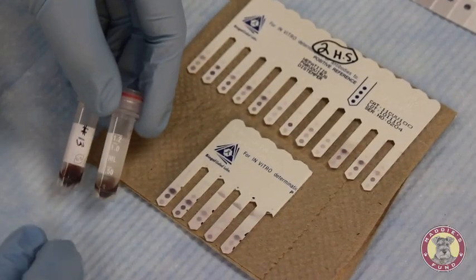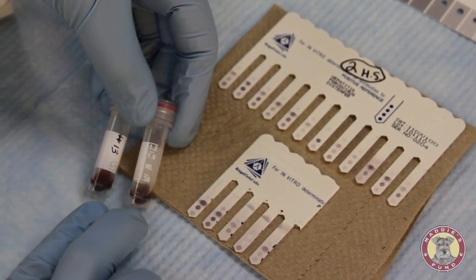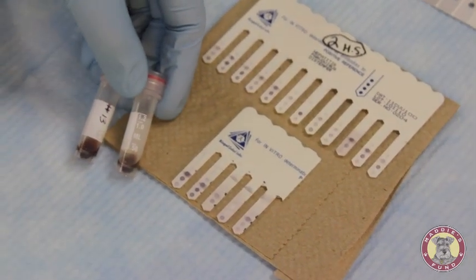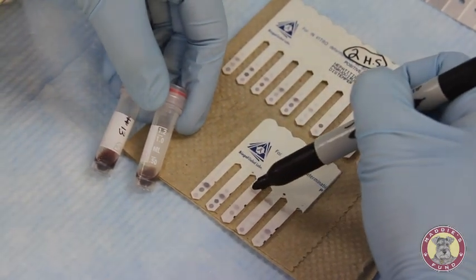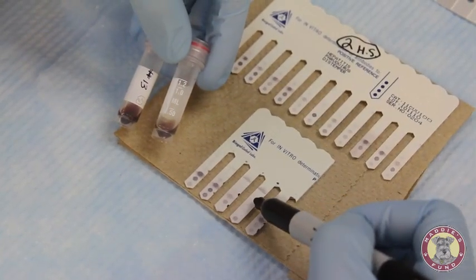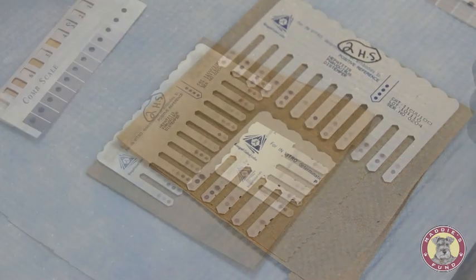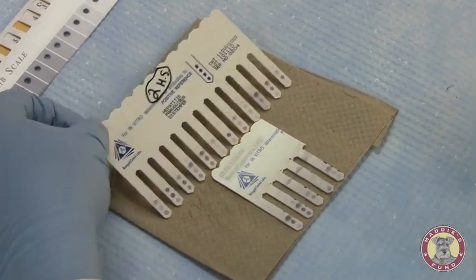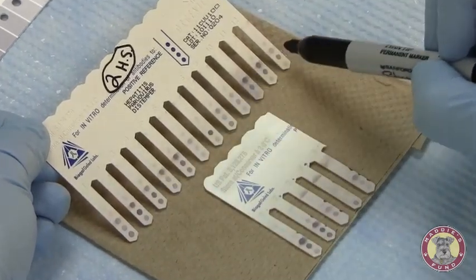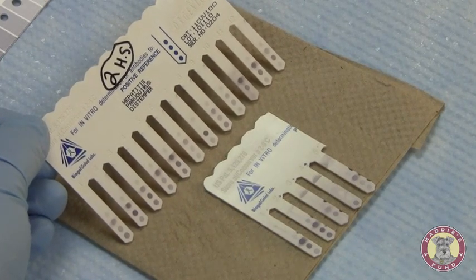Two of the samples used today were hemolyzed samples, loaded in teeth 3 and 4. We did experience a higher level of background with hemolyzed samples; however, we were still able to read the results on the teeth of that comb. Results from a previous comb where samples were not hemolyzed show very clear results with a low amount of background.